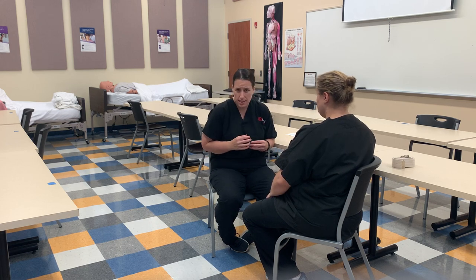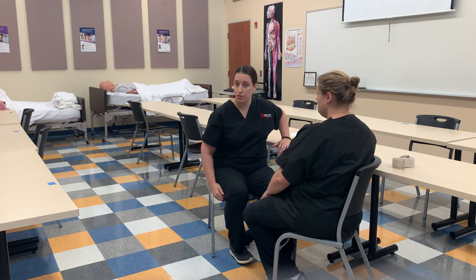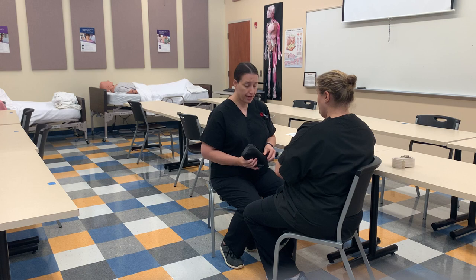If the patient isn't sitting up the right way, or maybe slouched over, or maybe the device is running out of battery, or their fingers are cold, or they have any kind of nail polish.